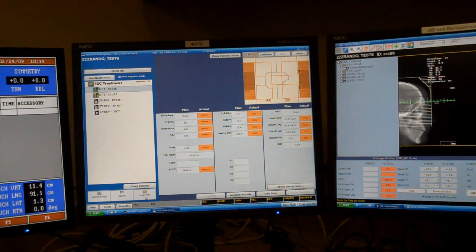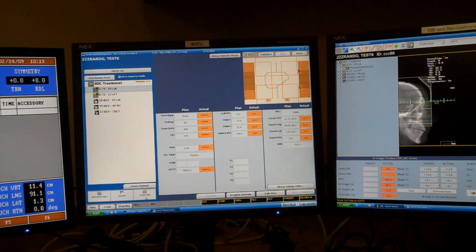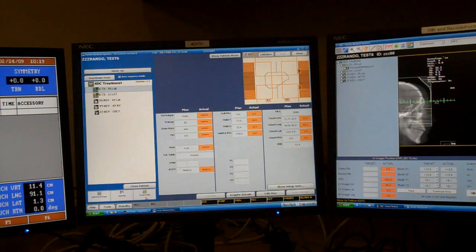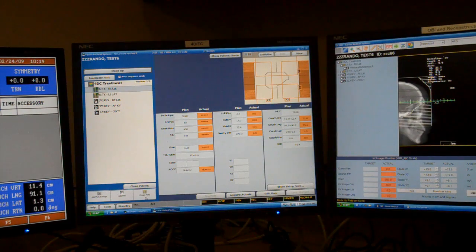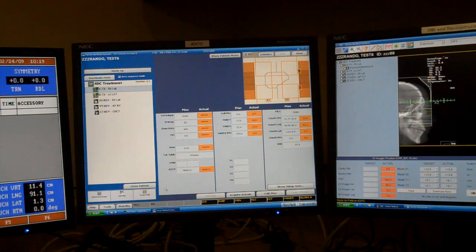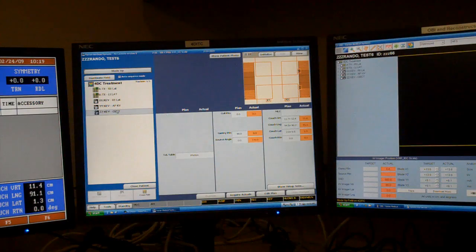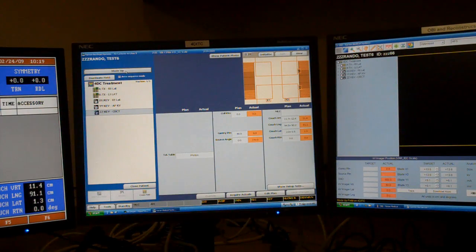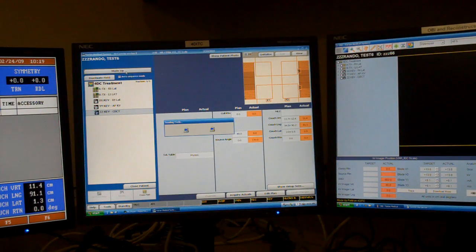This is a video showing what a Cone Beam CT looks like in the Varian software. So I've started with the patient already loaded, and I'm going to select the Cone Beam CT field and click Mode Up.